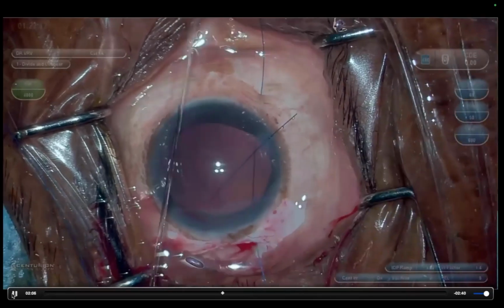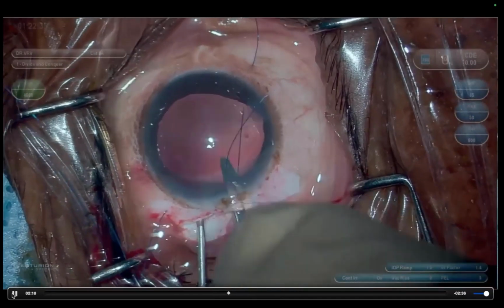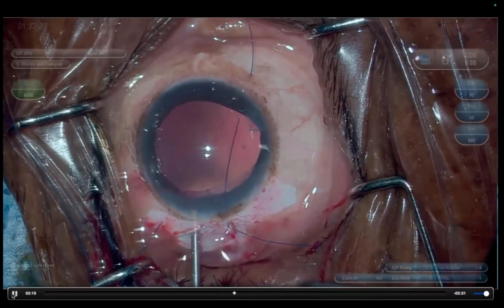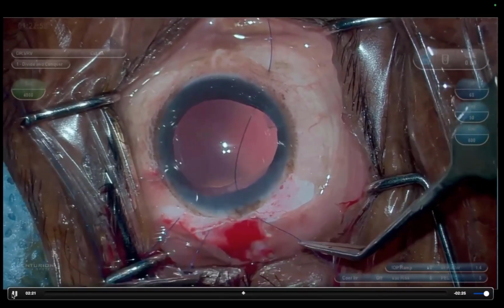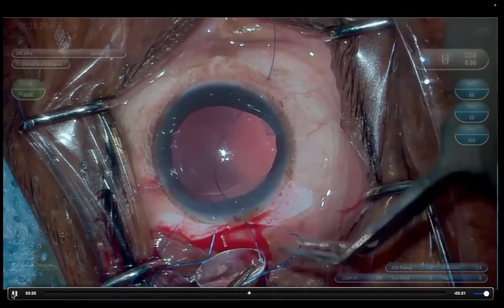Beginners, I would recommend you to do it with an AC maintainer. With an AC maintainer, you won't have that backflow of the blood and all that. It is a little safer. So now you have trimmed the needles on both the sutures. The next step is to make sure they are not intertwined. Make sure they are separate, right and left.